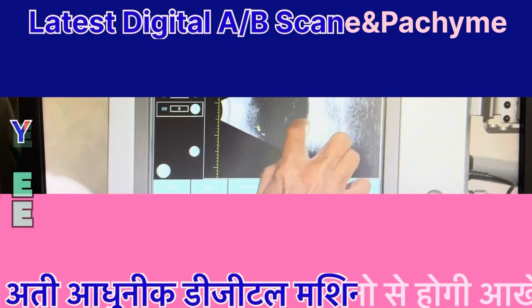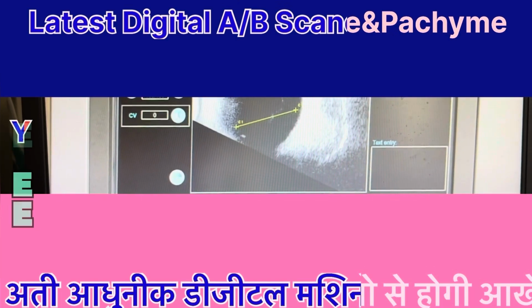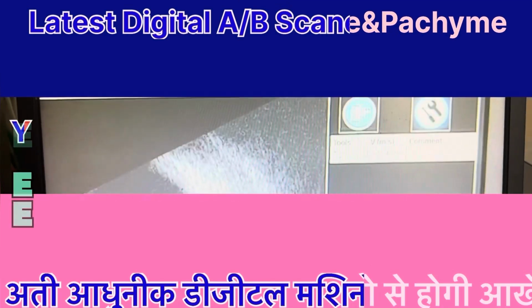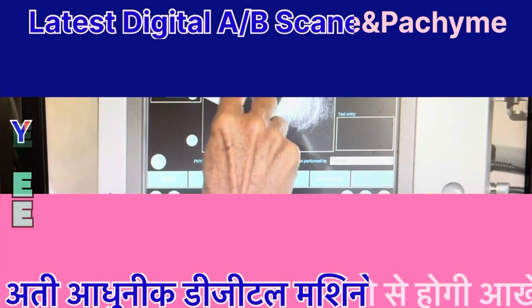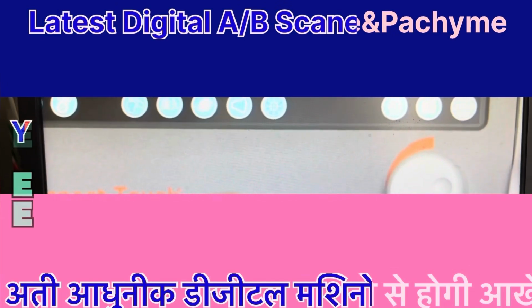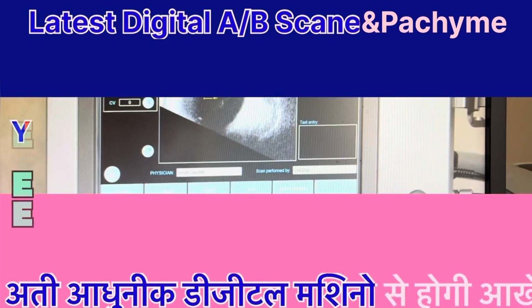Several image analysis tools, including caliper, marker, and area, can be enabled from the bottom toolbar. The caliper function measures the distance between 2 selected points on an image. After selecting the caliper function icon, use the mouse or touchscreen to set the position of 2 endpoints. The measurement will be displayed in the tool result table on the right-hand side of the screen.